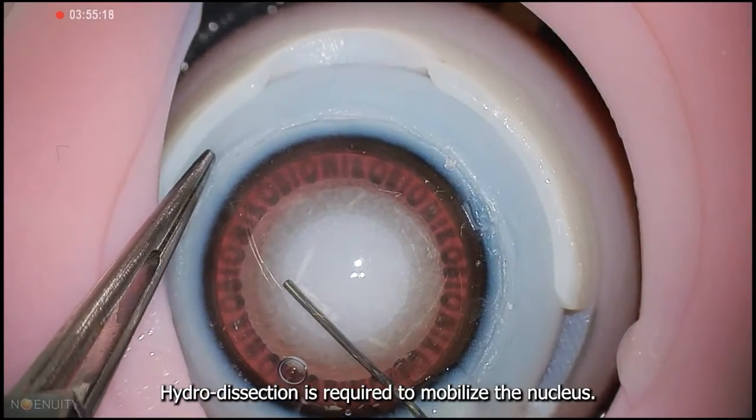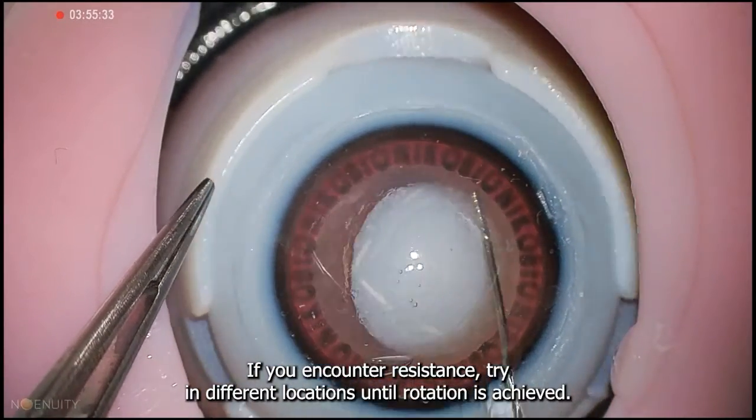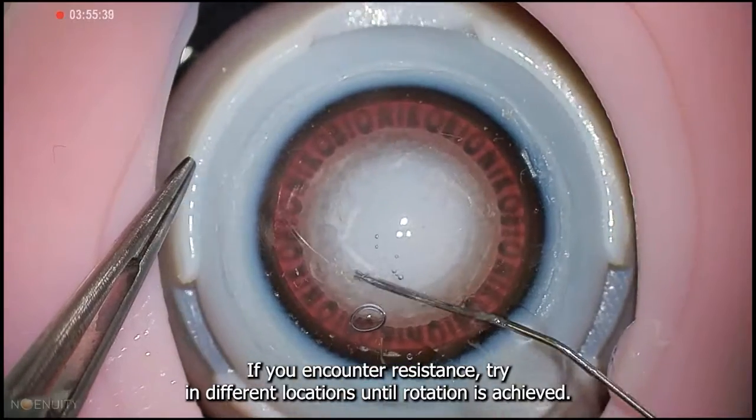Hydrodissection is required to mobilize the nucleus. If you encounter resistance, try at different locations until rotation is achieved.